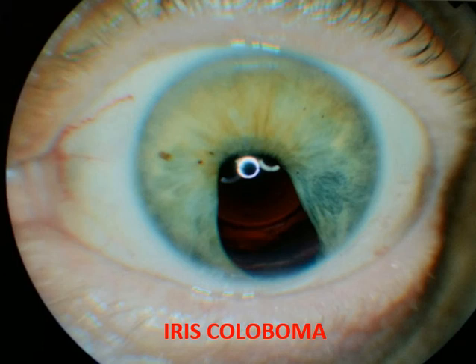And the other thing is, if you can see clearly, you can see the intraocular lens. So this patient is pseudophakic, that is, this patient had cataract extraction done followed by intraocular lens implantation. Doing a cataract surgery in these patients is quite tricky for the obvious reasons that the zonules can be weak, which may need a capsular tension ring to keep the lens stable. Sometimes these people can need scleral fixation of intraocular lenses, or the lens may need to be put in the anterior chamber, that is in front of the iris.